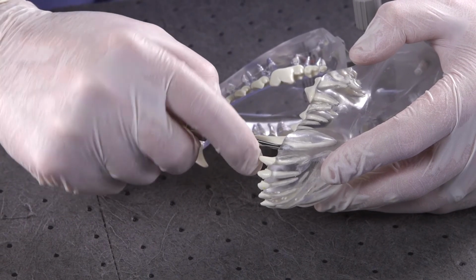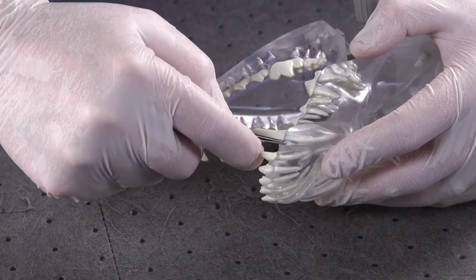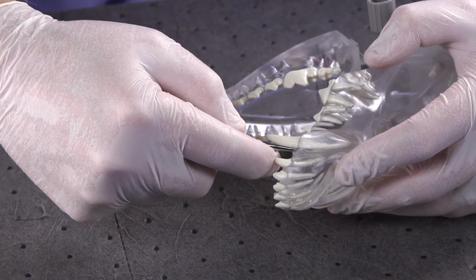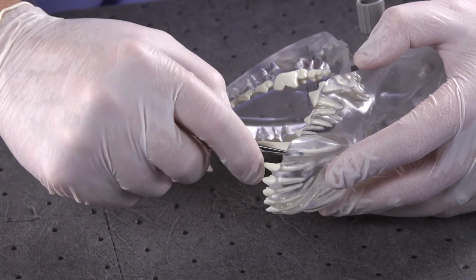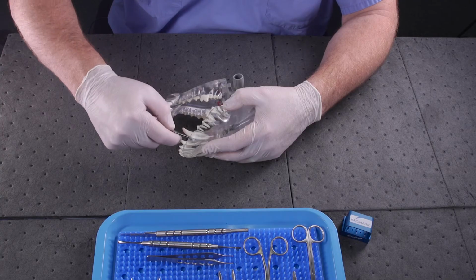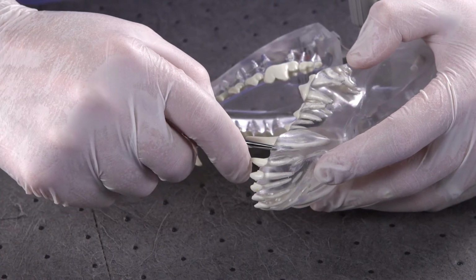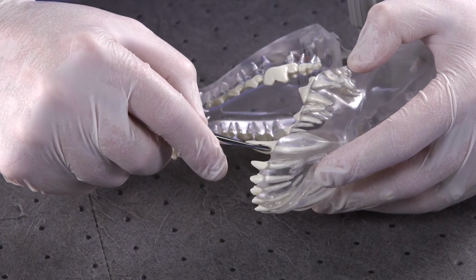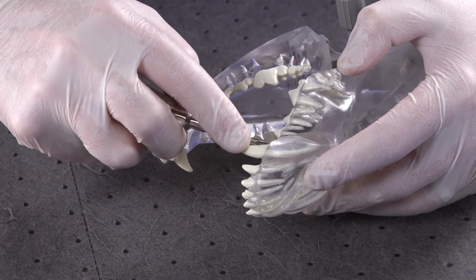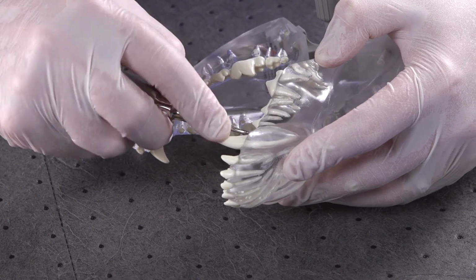And then I oscillate even deeper, going deeper down between the root and the bone, applying more twist and hold. And then I will go even deeper between the root and the bone, as far down as I can go toward the apex of the tooth, and continue to apply that twist and hold. When I've made some space on the mesial aspect of the tooth, I'll then go to the distal aspect of the tooth, working down between the root and the bone, pushing in as I oscillate back and forth.